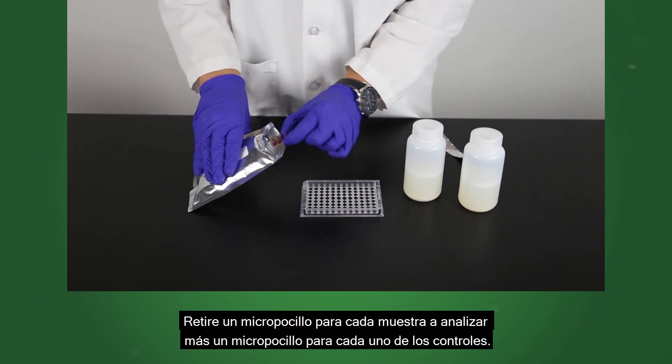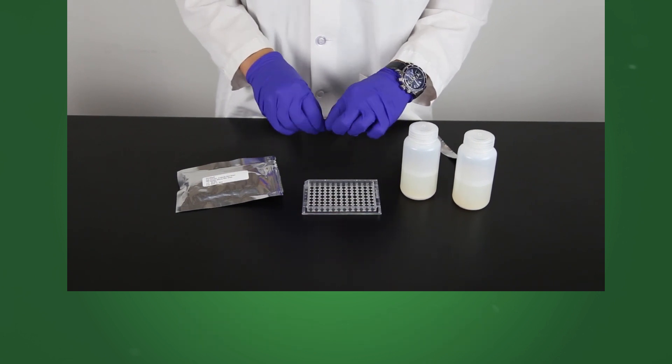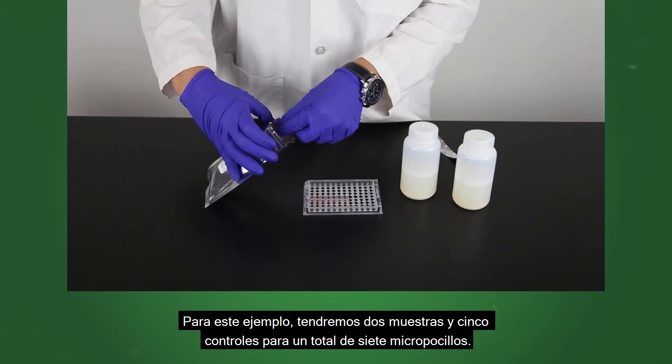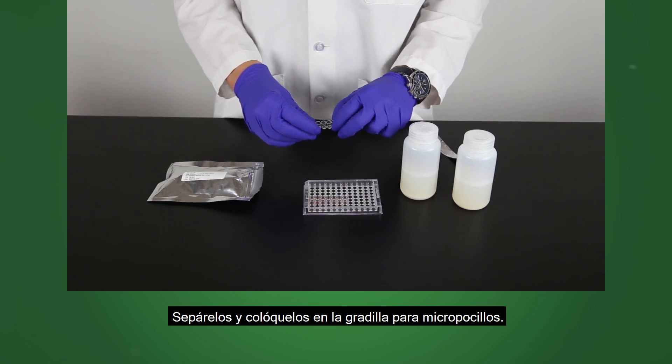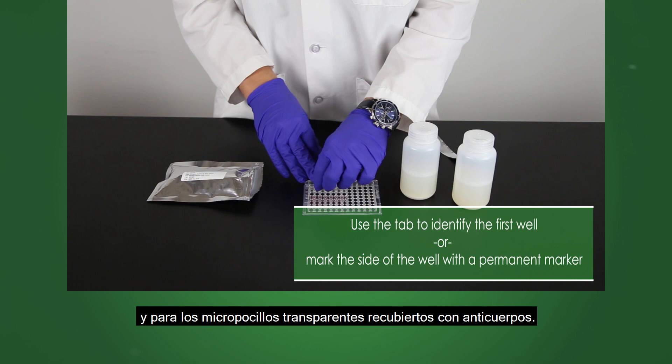Remove one well for each sample to be tested, plus one well for each of the controls. For this example, we will have two samples and five controls for a total of seven wells. Break them off and place in the well holder. Do this for both the red marked transfer wells and clear antibody coated wells.